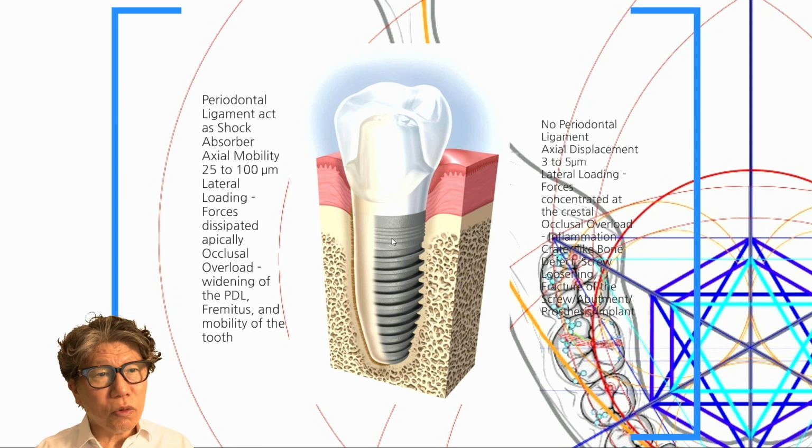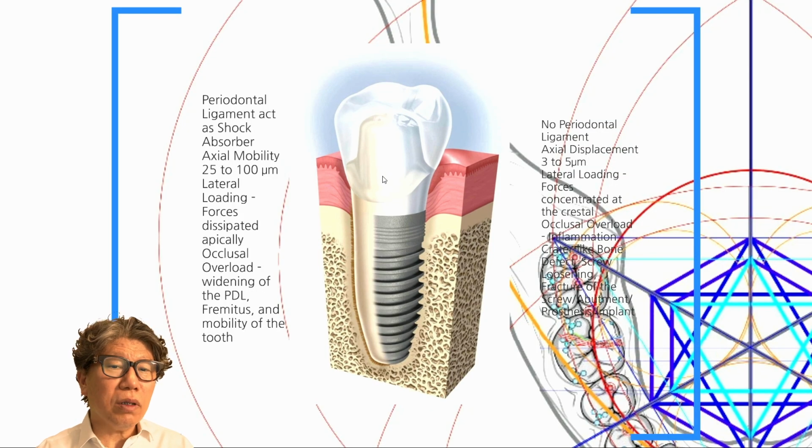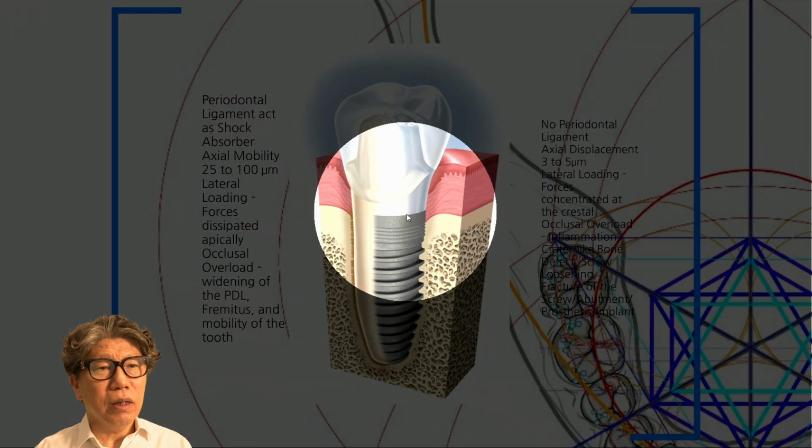And the superstructure is ultimately the implant abutment. Because an abutment made of pure titanium is somewhat weak, it seems that the regulations have been almost unified with the 64 alloy. They don't do HA coating, and almost every implant company uses 64 alloy. So they are making almost all prosthetic elements, like the upper abutment, with titanium grade 5. So it's a bit funny. Almost everyone uses titanium, and the upper part is standardized with 64 alloy, which is difficult.